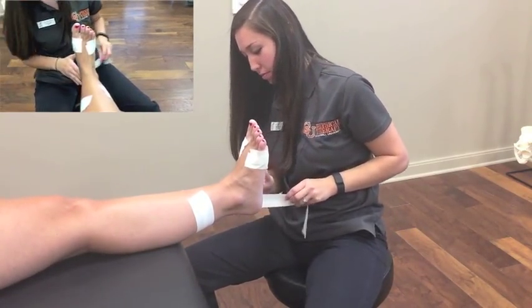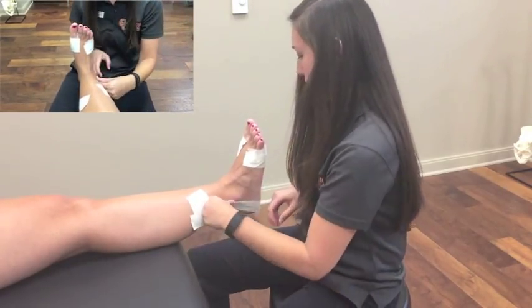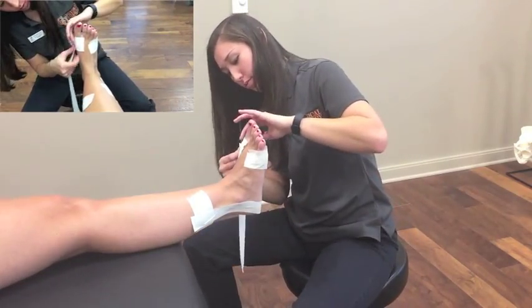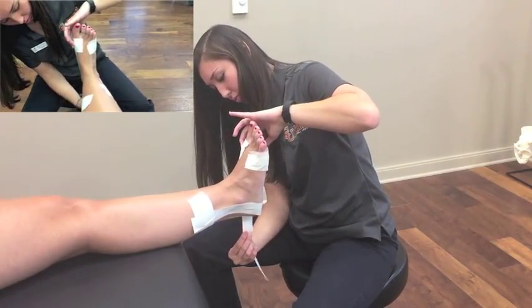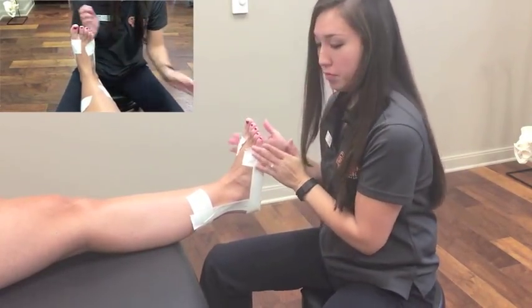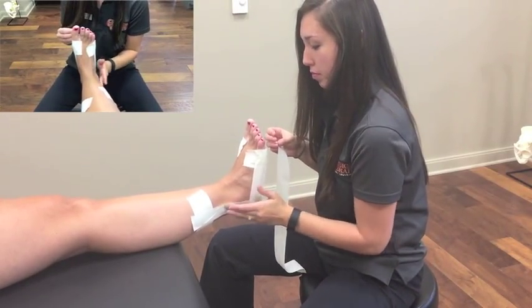Then you will apply the first stirrup, starting on the medial side for an inversion ankle sprain and the lateral side for an eversion ankle sprain. I am demonstrating the inversion taping technique here. Now you will apply the first horseshoe, again starting on the medial side. Wrap the tape around the back of the ankle and attach it to the anchor on the lateral side.